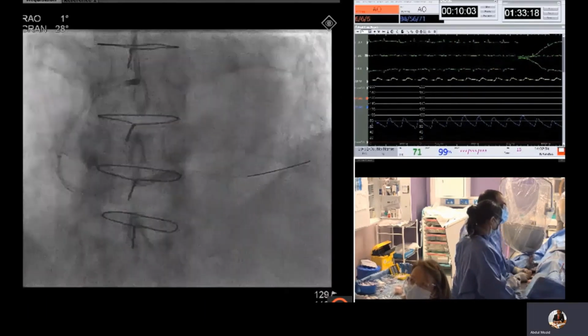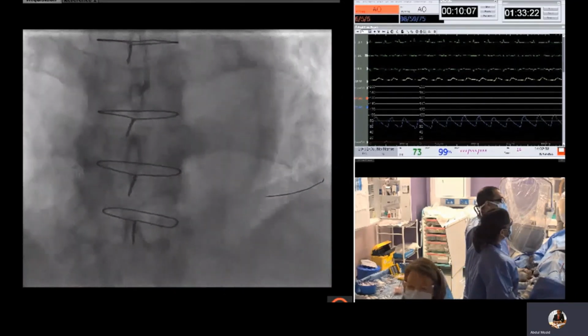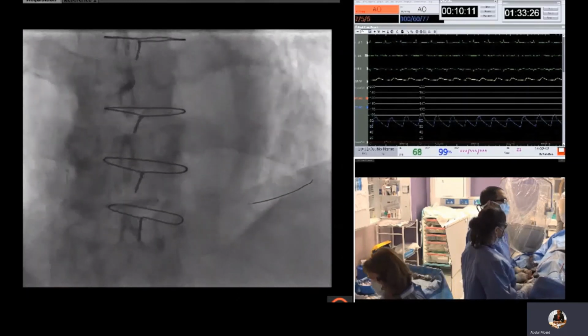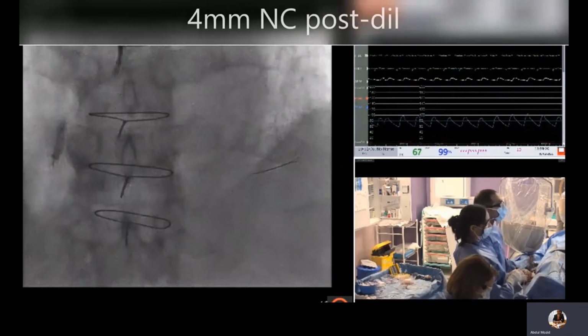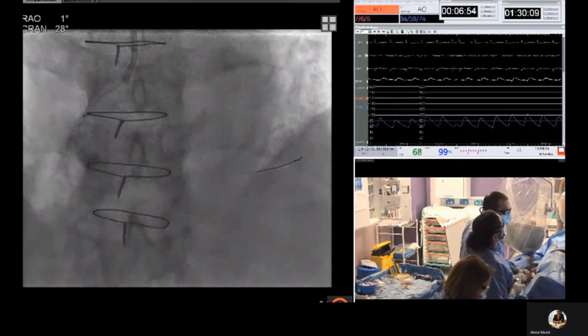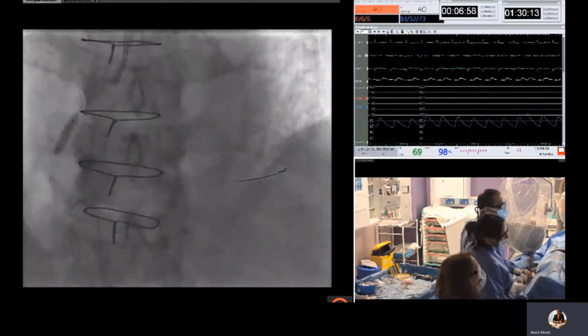And this is an important learning point on the initial angiographic images. One would feel that the PLV would be at most a 2.5 mm vessel, but here you can see we're now post-dilating this with a 3 mm NC balloon, and the proximal vessel was optimized further with high pressure 4 mm NC balloon inflations.